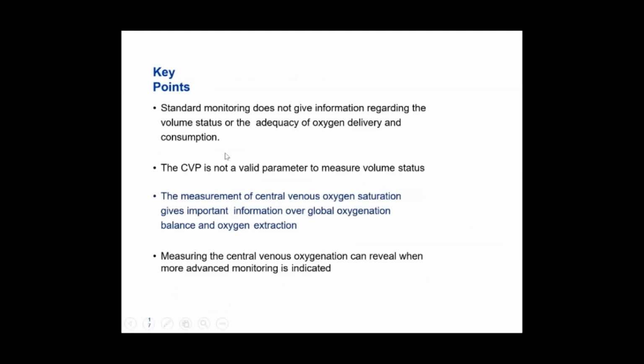So here we take the key points. Standard monitoring does not give information regarding the volume status or the adequacy of oxygen delivery and consumption. The CVP is not a valid parameter to measure volume status in isolation, but the trend of CVP can be helpful. In isolation, the CVP has its limitations.